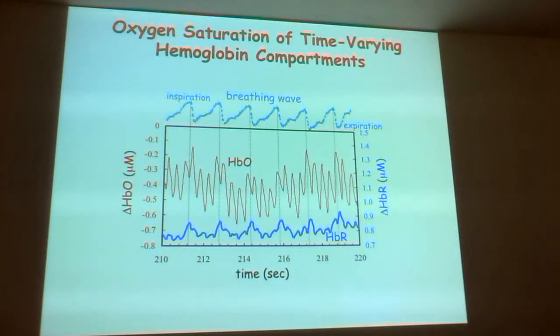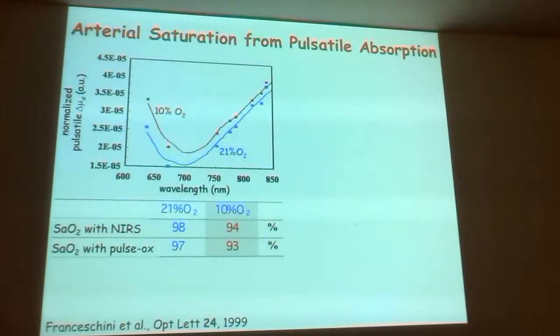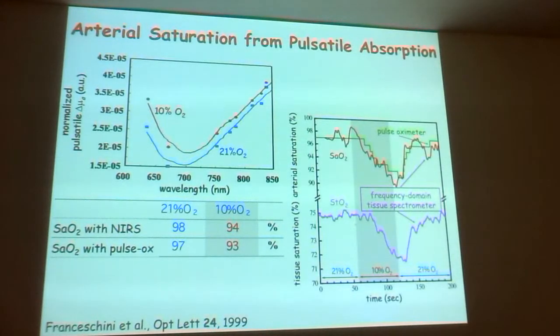Okay. Actually, if you could go back one slide, I have a question. Are we talking about humans? This is human. I've done this experiment where I've fed humans with 11% oxygen. They wouldn't let me go below that. And they get down to 70% on a pulse oximeter. Really? 70% on a pulse oximeter? It's a good thing they don't let you go below 11%.